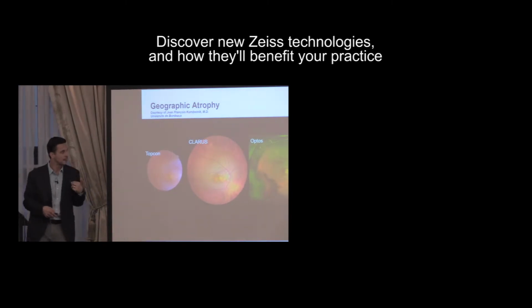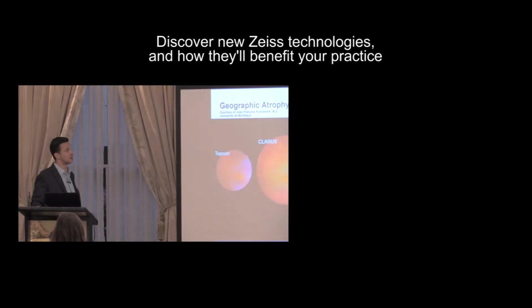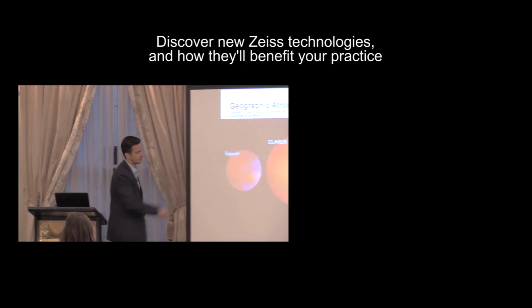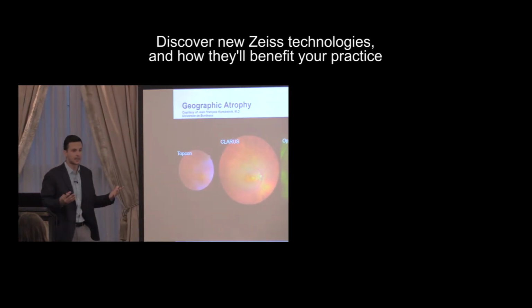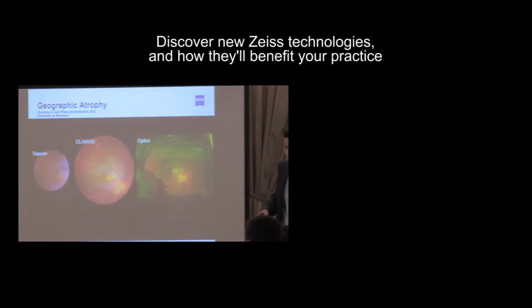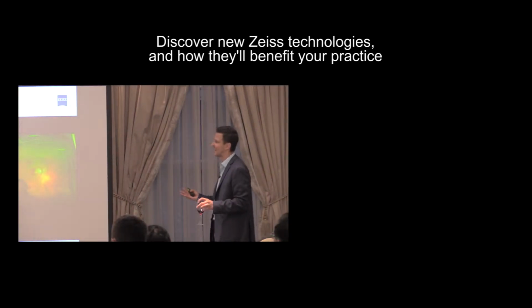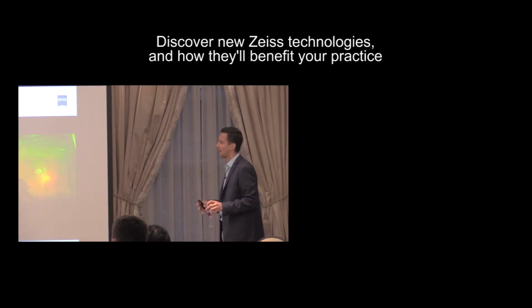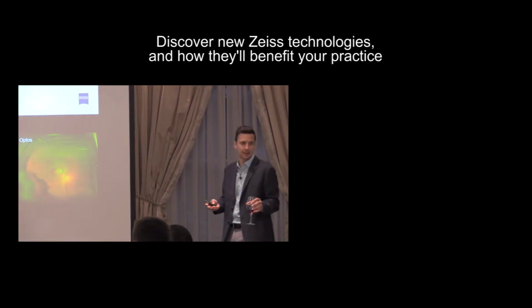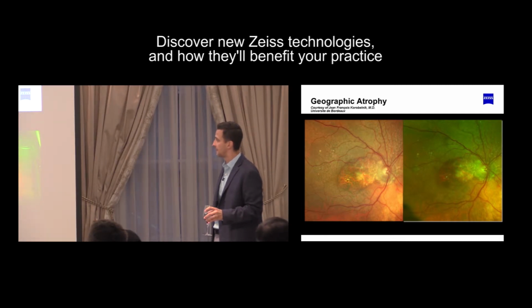And then here we have our comparisons to the other ultra-wide field devices that are out there, and a comparison to what we've got associated here with our regular retinal photography. So again, with traditional retinal photography, we want to know, are we looking at something that's true color? Does the image quality stand up to what I'm used to having? Or am I looking at something that's going to lead me down a path that maybe isn't the right path diagnostically? So your Topcon, your Clarus, and your Optos are side by side.